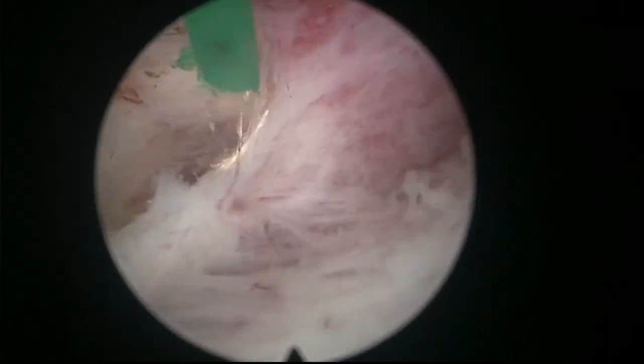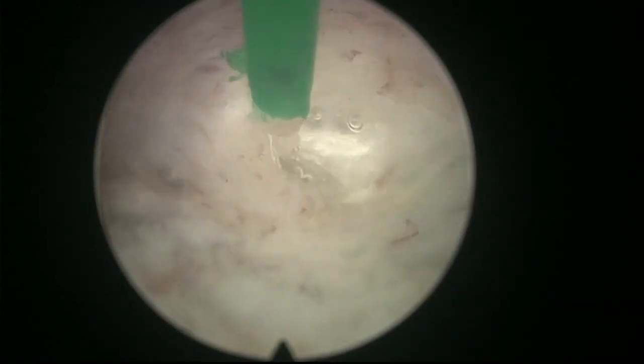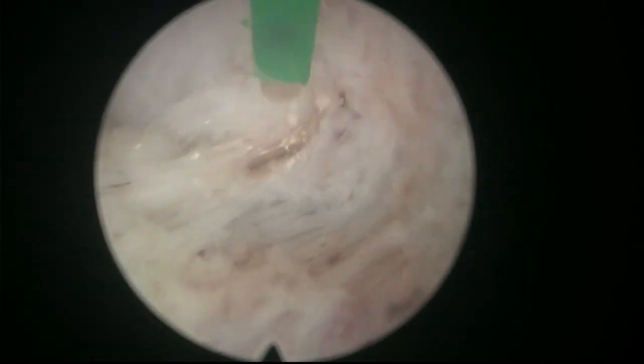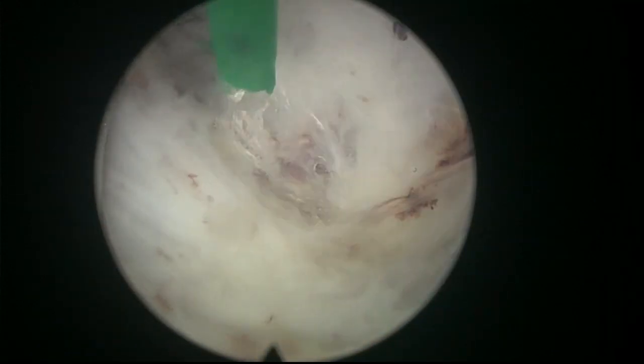Well, we have information about the bladder because we did an ultrasound before the operation. And it looked normal, and that's why I take this, let's say, approach. I think most people would try to get into the bladder to see what's in the bladder before starting the procedure, but I think you have ultrasound information and you can start your enucleation and then check the bladder at the end.